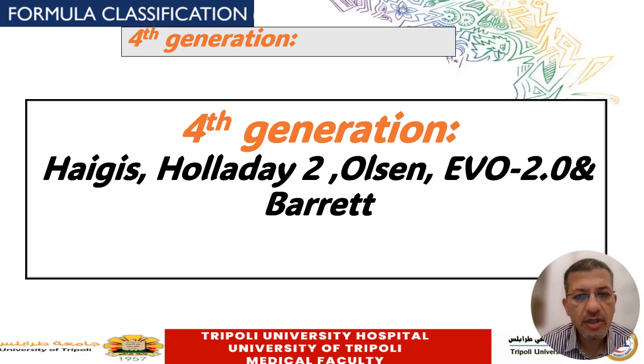Now, after finishing talking about the 3rd generation formula, the time has come for the 4th generation. This came after the problems facing doctors with the advancement in keratorefractive procedures, and LASIK and post-LASIK cases that need IOL calculation. Also, the occurrence of new generations of IOLs like the premium lenses, the toric lenses, the extended depth lenses, and the elevation of patients' expectations for cataract surgery. As I said before, cataract surgery becomes cataract refractive surgery. So the need for a new generation of IOL formulas that suit and solve all these problems for the patients becomes a necessity for all doctors, and that's why the 4th generation started to include more than a constant for the prediction of the effective lens position, and uses different principles.